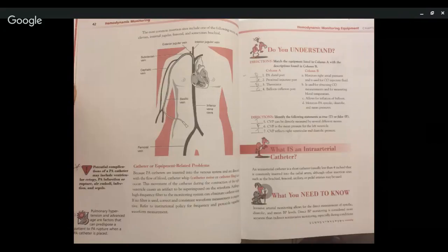Because on page 3 it says CVP measurements can be directly measured by several different methods. If a PA catheter is inserted, the right atrial port can be used for monitoring right atrial pressures. Another method of measuring CVP is by placing a central line in the inferior vena cava, superior vena cava, or right atrium.